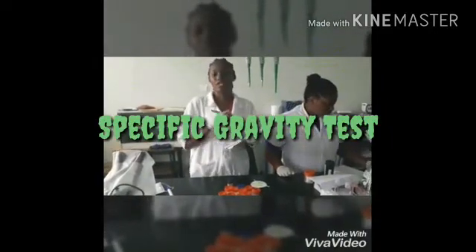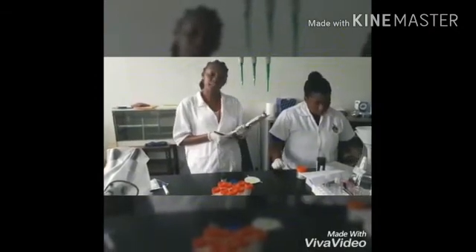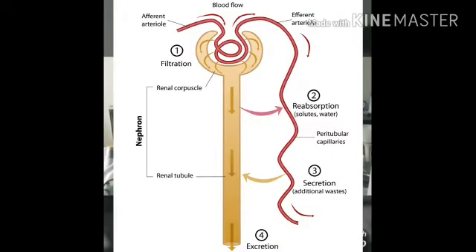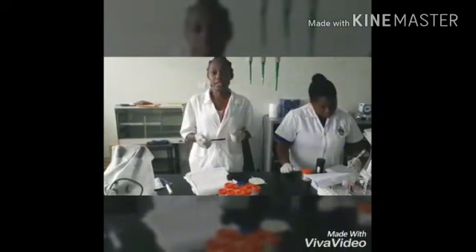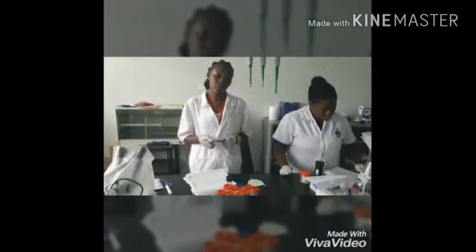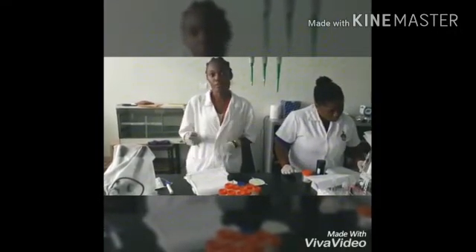Specific gravity measures the concentration of solutes in the urine and gives information on the ability of the kidneys to concentrate the urine. The test demonstrates the potential of the renal tubules to remove water from the urine and return it to the blood. Basically, the test compares the density of urine against the density of water, which has a specific gravity of 1.00, which can determine how effective the kidneys are in monitoring the body's overall balance of fluids.